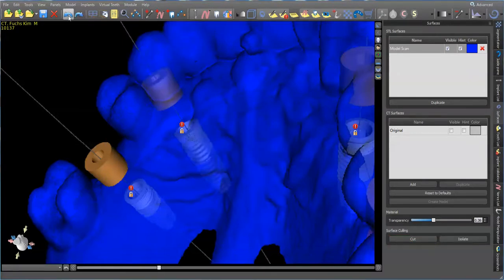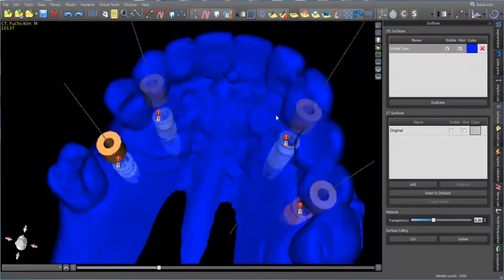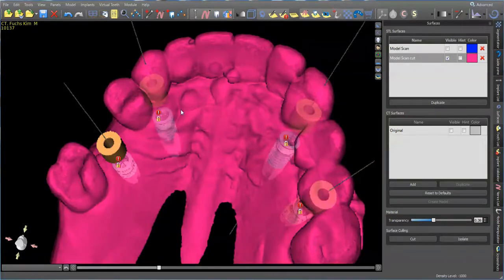So what I'm going to do is, actually, it's a common mistake that I always make. Before you do anything to a permanent mesh, you should always take this model and duplicate it. And it's super easy to do. All you have to do is click this button here, and I'm going to call this duplicate, or you can call this cut, because I'm actually going to cut this one. I'll turn this one off, change the color on this one to pink, and we'll work in this.